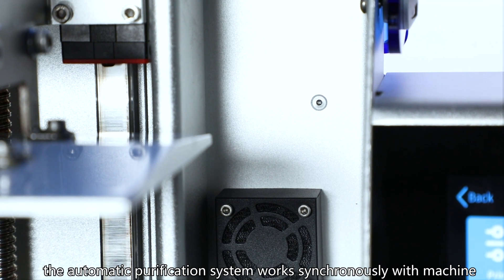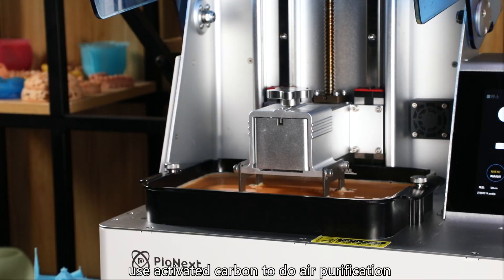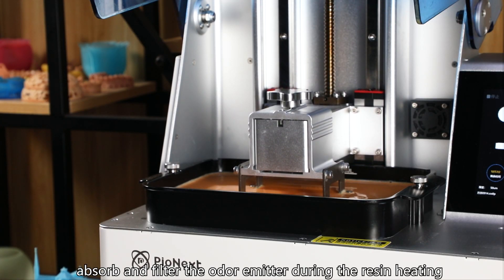During the printing process, the automatic purification system works synchronously with the machine. It uses activated carbon for air purification, absorbing and filtering the fumes emitted during resin heating.